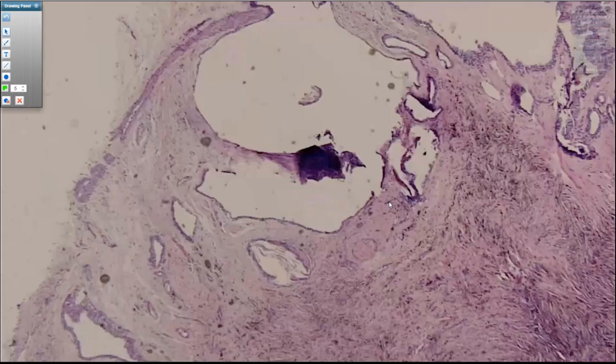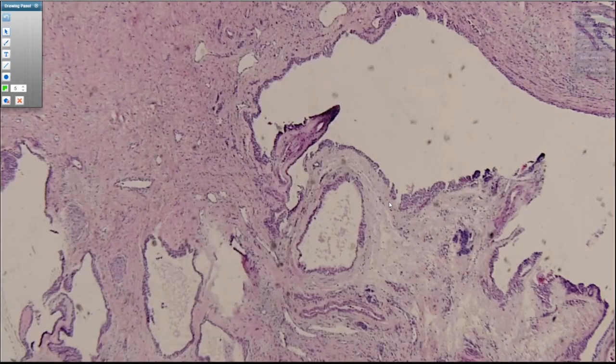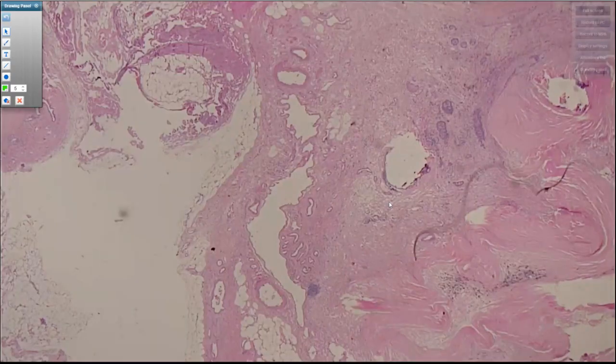It can be much more extensive, and there have been cases where you're left with only maybe 5% of this whole cystic area actually containing that epithelium anymore. And I'll show you a couple of examples of a little more extensive degenerative change.